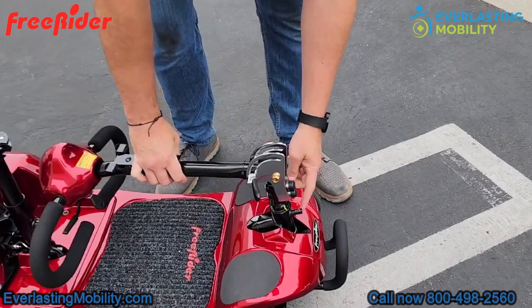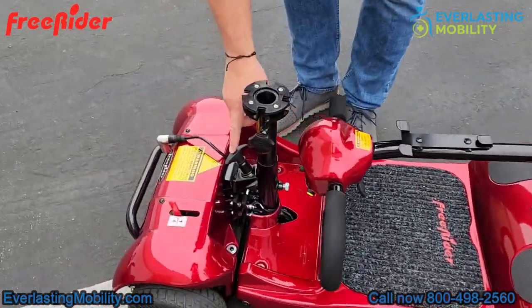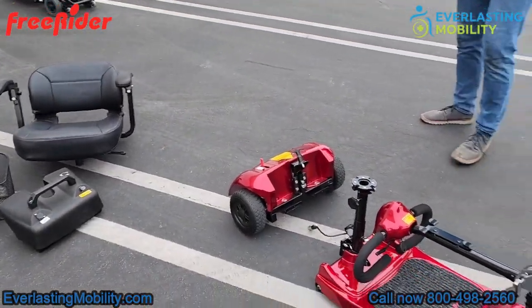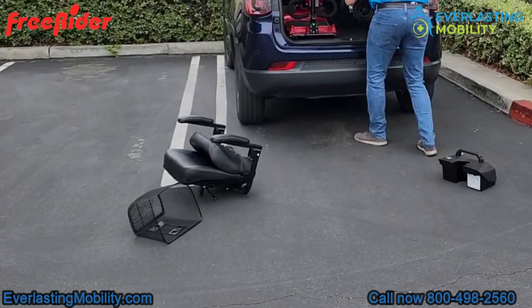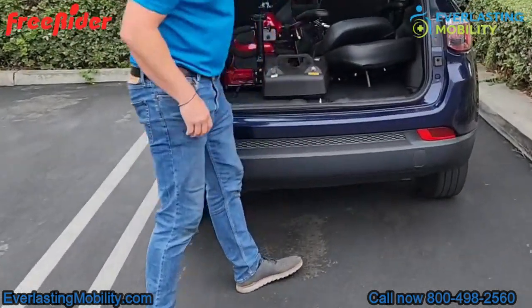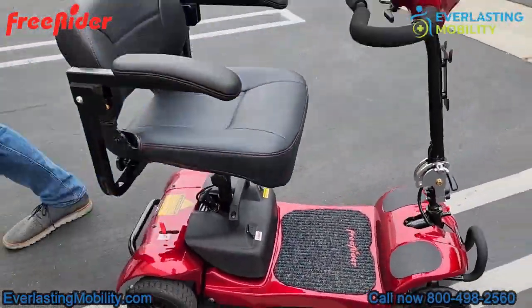There's also a knob on the front of the tiller to lock it and prevent it from steering back and forth in transit. Finally, there's a knob on the back of the rear wheel assembly — lift that up to release the front half from the rear wheel assembly. Now you've broken the scooter into more manageable pieces. The heaviest piece is 33 pounds, making it easy to load into an SUV. Reassembling is just as easy — simply go through the same steps in reverse.